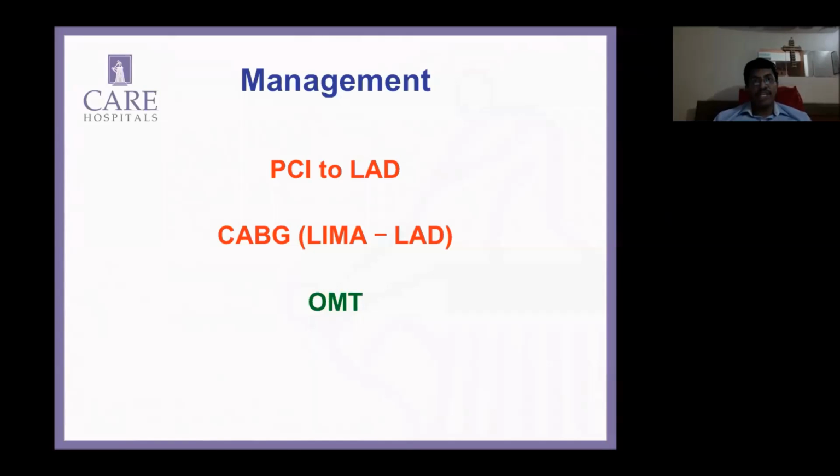I think CT is not the greatest of tools for viability, as you said. We would do MRI as the first thing because it is non-invasive, no radiation. Our choice would be MRI, no radiation. And MR, obviously, at this point of time, has much more data, much more superior spatial resolution, with all the other advantages for mitral regurgitation, aneurysm, and everything that goes with it.